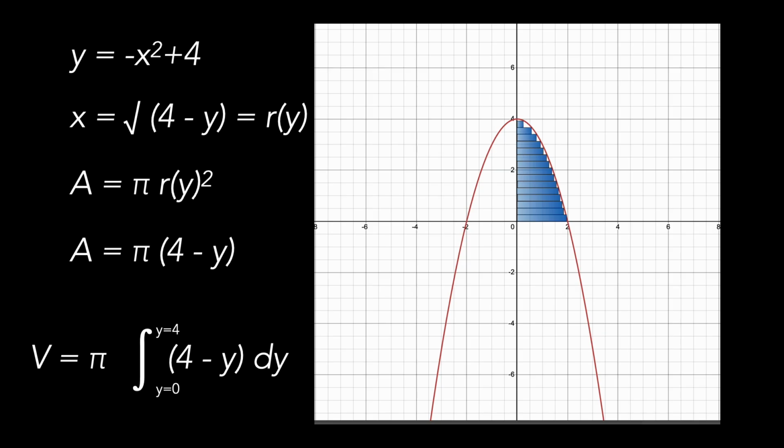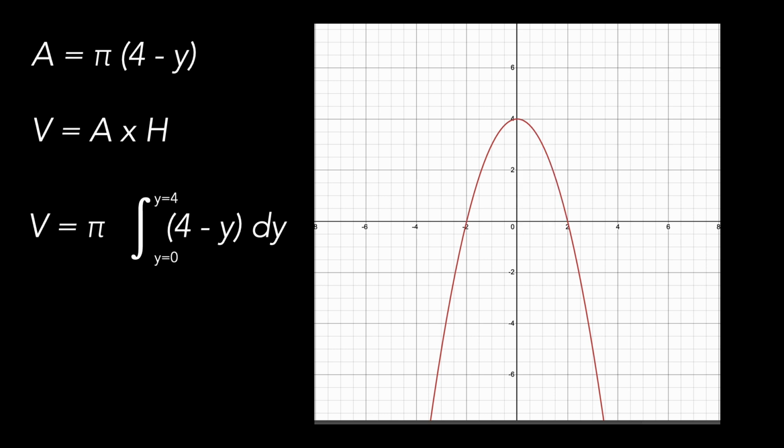You're going to hear this stacked coins or stacked discs method of calculating left ventricular volume. And so we find all these things. We integrate the area under that curve, and we can really, at the end of the day, come out with a volume after we multiply it with pi and all sorts of other calculations. And so I know it's complex. It's a little bit nerdy, kind of getting into the calculus of how we measure. But what happens in the ultrasound machine is the machine does this for you. And when you're doing your ultrasounds, you can actually have the machine produce the calculus to give you some volumes. And so this is what's called the Simpson's method for left ventricular ejection fraction.